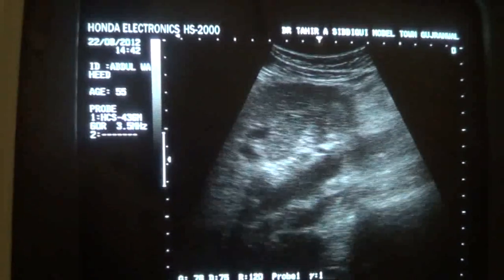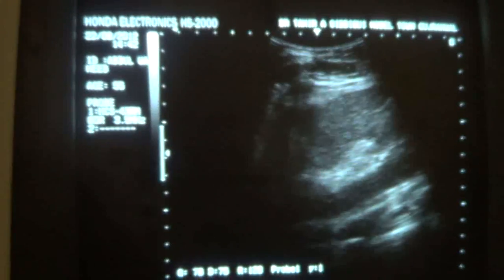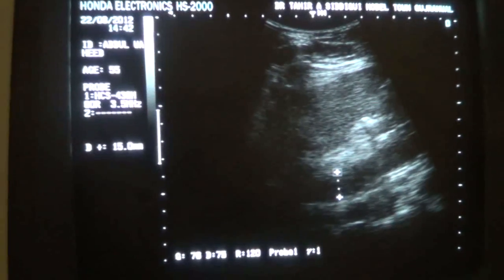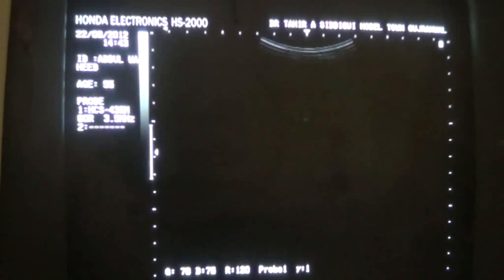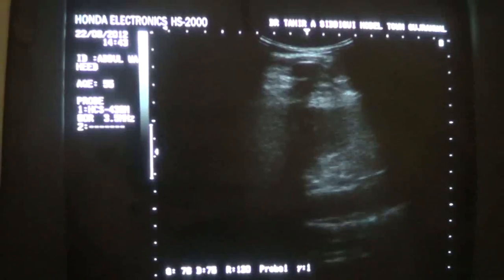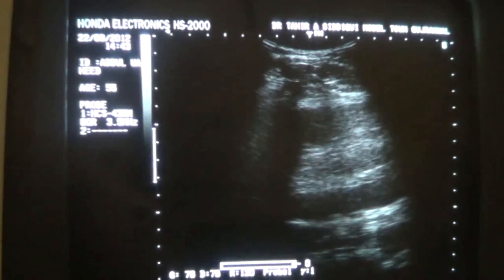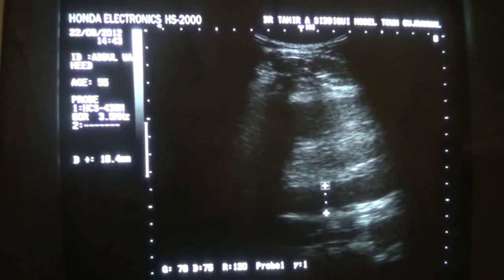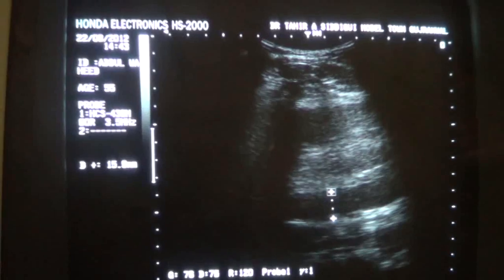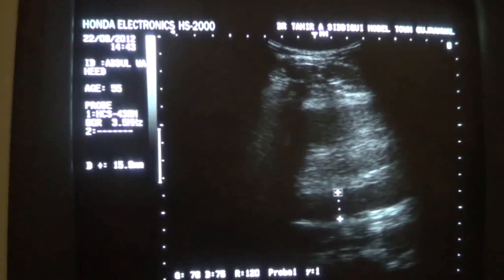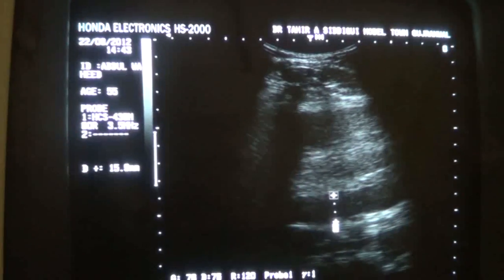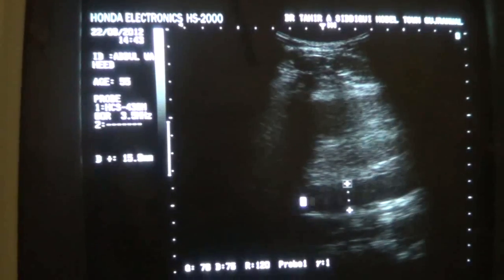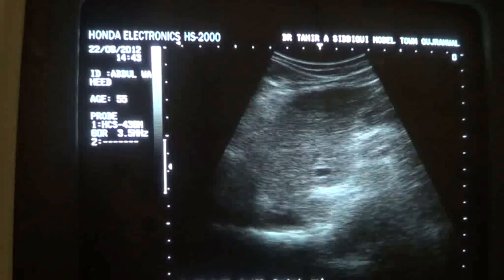This is the portal vein. The portal vein should not measure more than 13 mm from inner to inner border at the level of the portal hepatis. We will always measure from inner to inner. It measures approximately 15.9 mm, so the portal vein is dilated. It is patent — there is no evidence of clot.